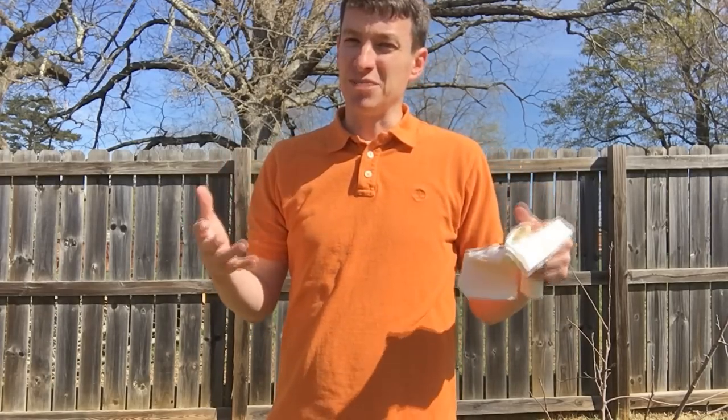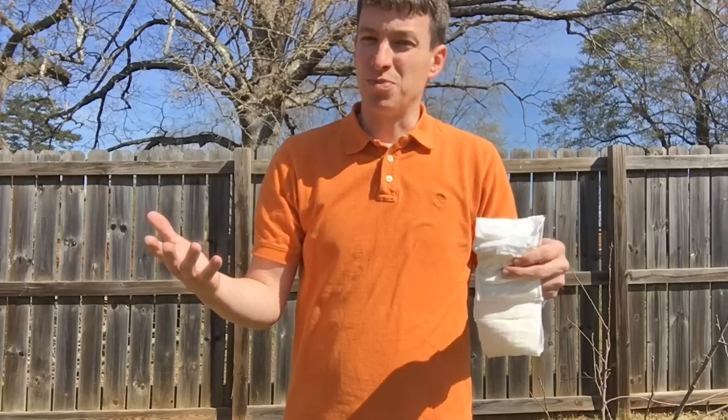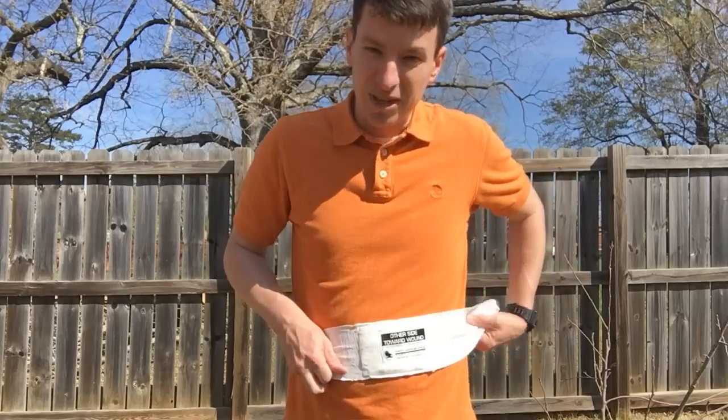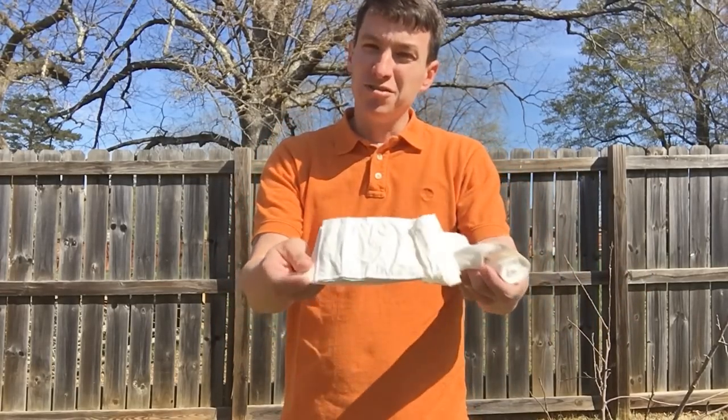Just be really careful not to over-compress the chest area because your patient may have a hard time breathing. If you had some broken ribs, you could use one of these bandages to splint them in place. Abdominal injury is the same thing — wrap it around the abdominal injury to support the bleeding and keep the intestines on the inside. Just be very careful not to over-compress this area as well, because you may hurt the breathing process and the expansion of the chest.